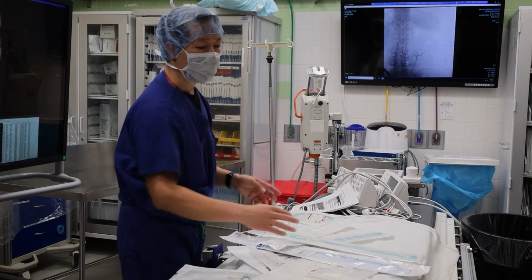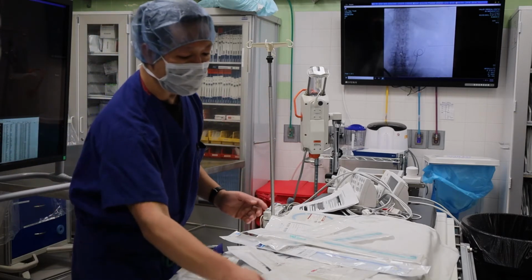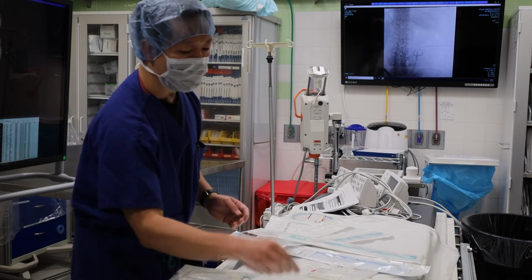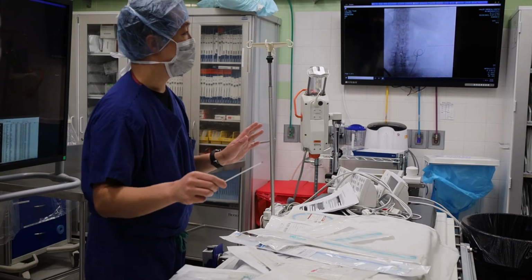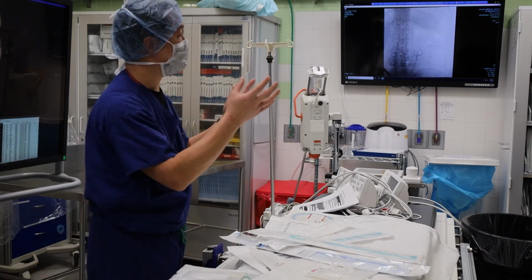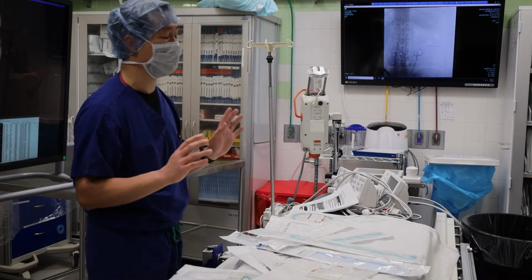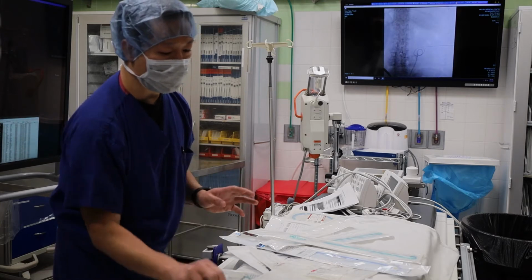So let's go back to this patient. Old patient, septic shock. We get this in, great. We get this in, great. We get this thing in. Sometimes we then inject contrast to make sure we didn't rupture the kidney. Sometimes you can actually be outside the kidney, but in the capsule and stuff around it, and it looks like the kidney, but you're not sure. That's why sometimes people take extra care. And then you put this in, you put this wire in.